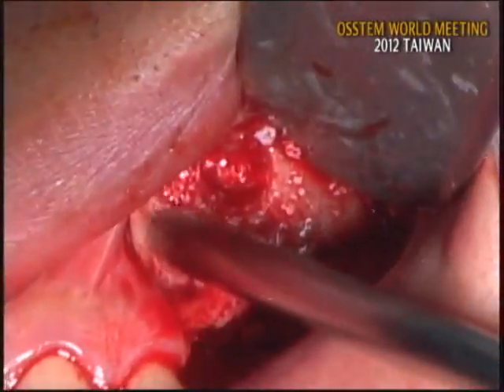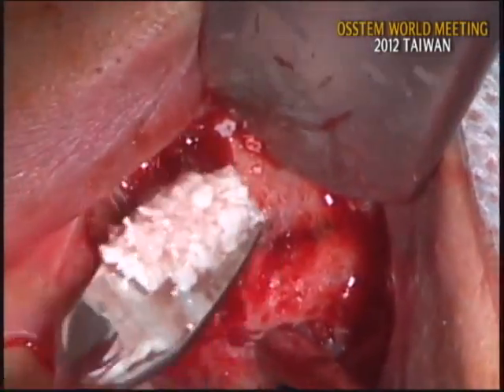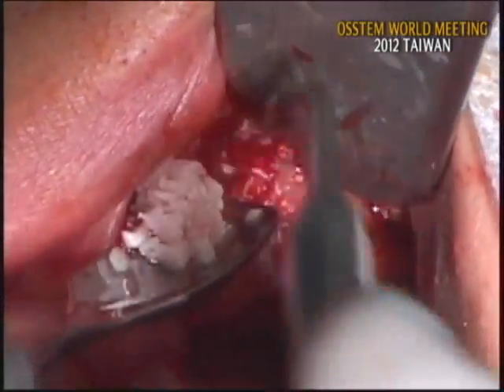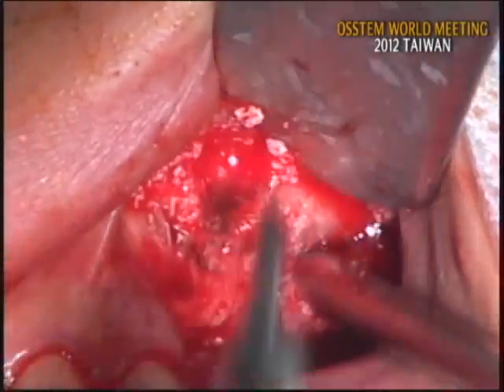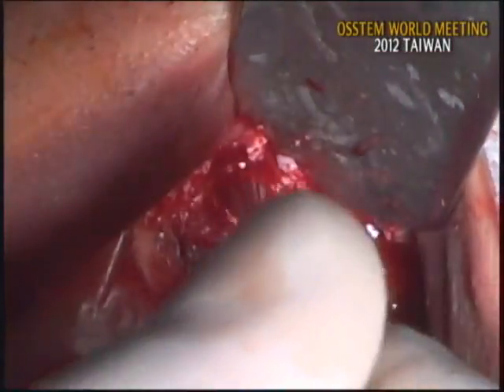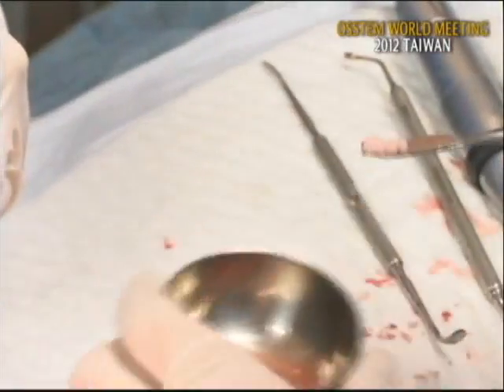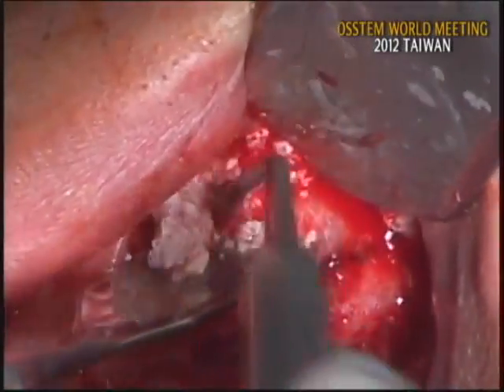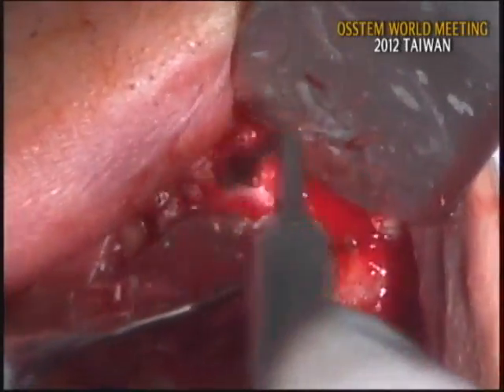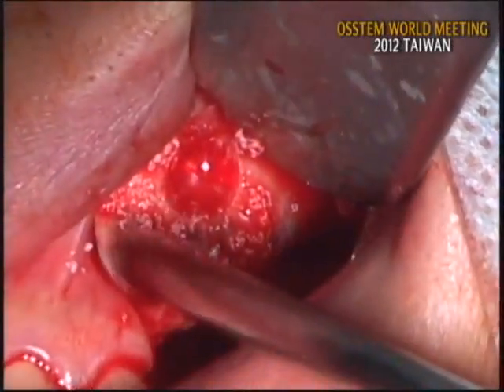Okay. I think not so much graft material is required, especially in the premolar area, where the bone height is more than 7 millimeters. And the sixth site, the molar site, the bone height is about 3 to 4 millimeters. In fact, I like allogenic bone graft material, but it is not available in Taiwan, so I'm using the BIOS.